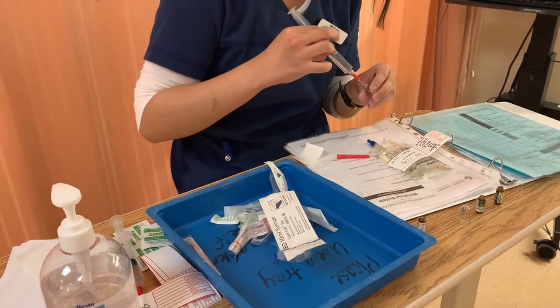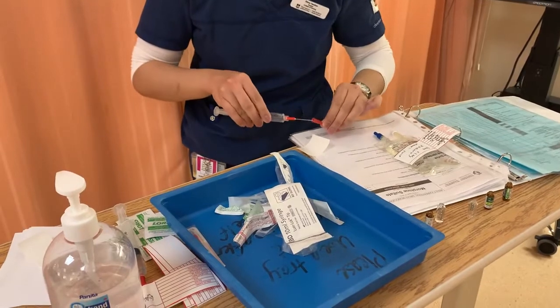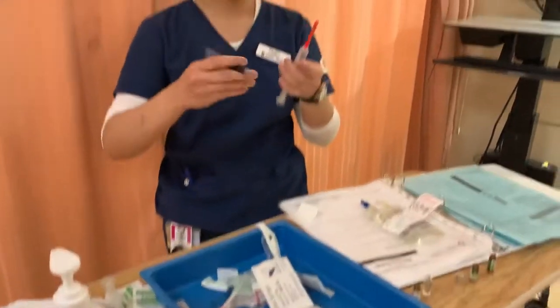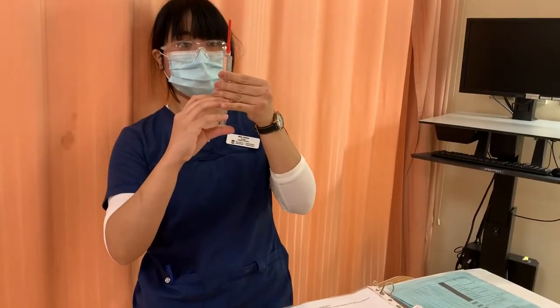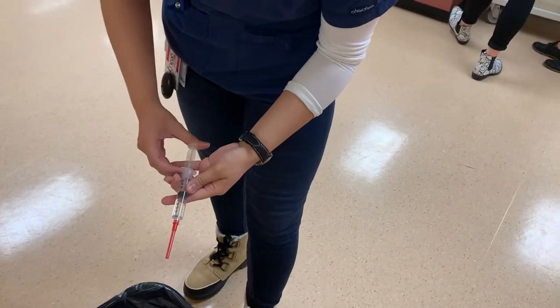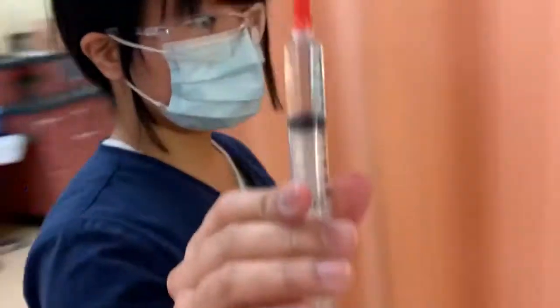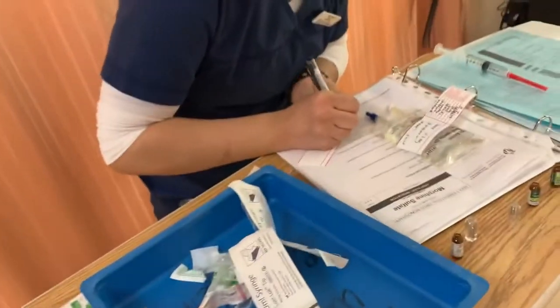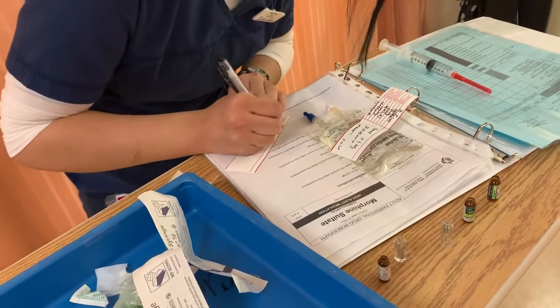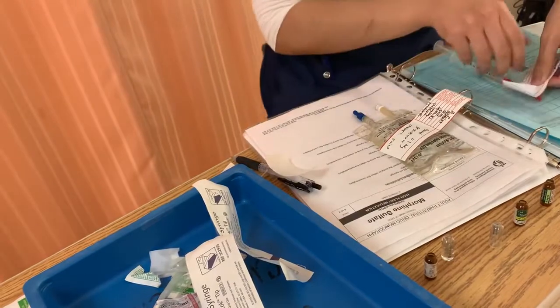Just gonna make sure I have the correct one. I'm just gonna recap that for now while maintaining sterility. Okay, just gonna take out the excess air bubble. I have some excess, so I'm just gonna discard that as well. So right here, the med waste container, I'm gonna take out the excess, and we got our 5 ml of morphine right here. So now I'm gonna label that as well. So morphine, and it is 50 milligrams and 5 ml, just so we don't confuse it with anything else.